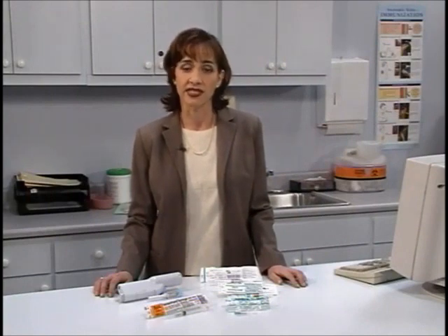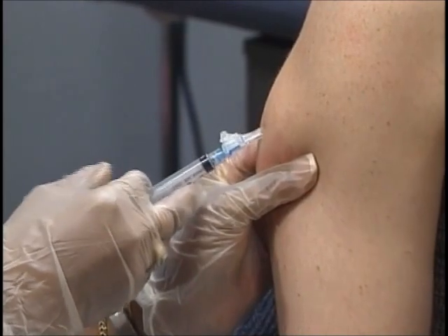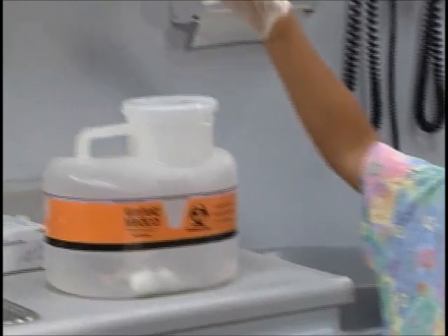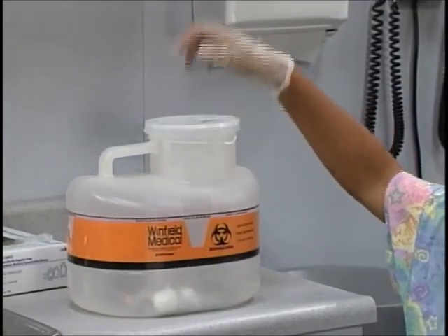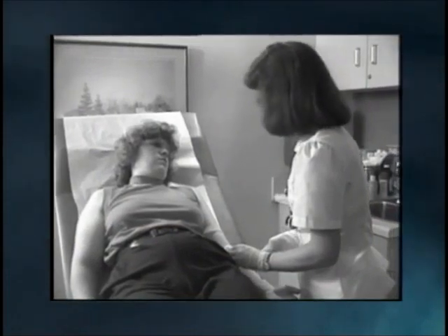So you need to take precautions to avoid needle stick injuries after the needle has been used on the patient. Minimize handling of needles by putting the needle in the patient and into the disposal box without setting it down in between, and never recap a used needle. Sometimes, despite all your precautions, accidents can happen.